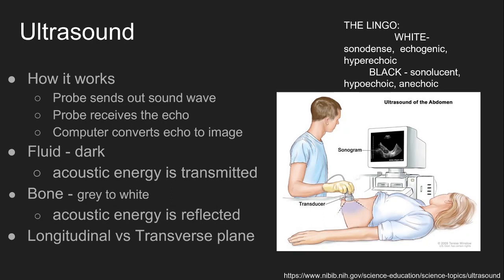Our next modality to discuss is ultrasound. I am sure most of you have seen an ultrasound machine before. Ultrasounds have many applications, including but not limited to transabdominal or transvaginal to look at a developing fetus, transrectal to visualize the prostate, or transthoracic and transesophageal to evaluate heart structure and function.